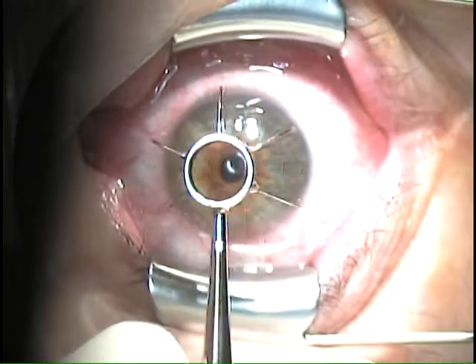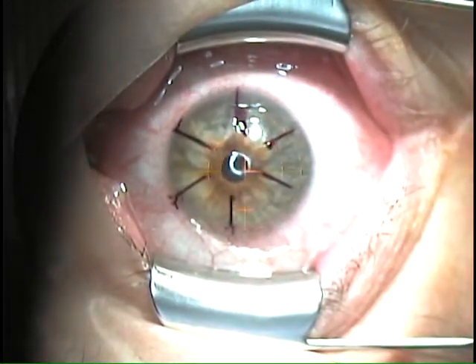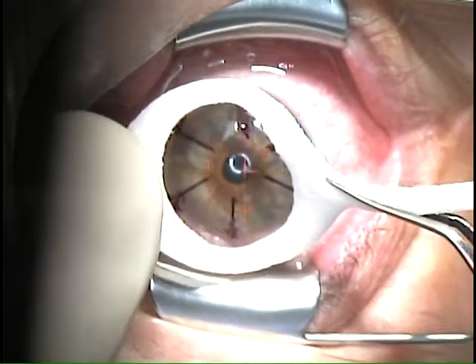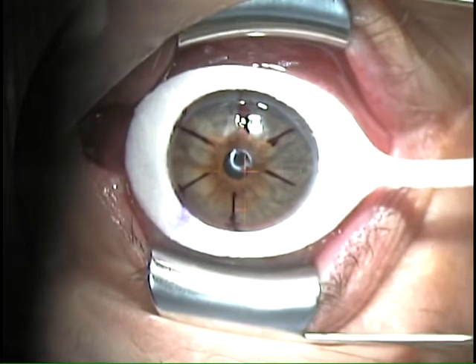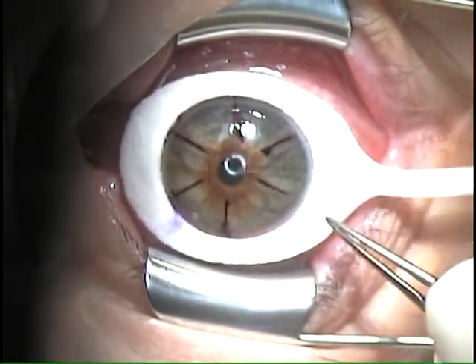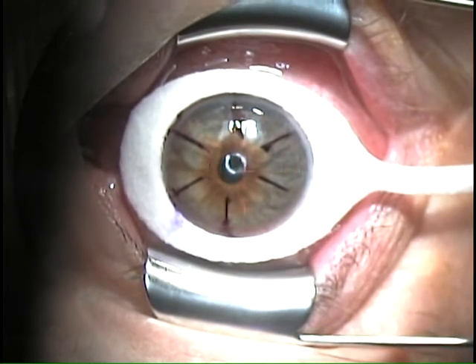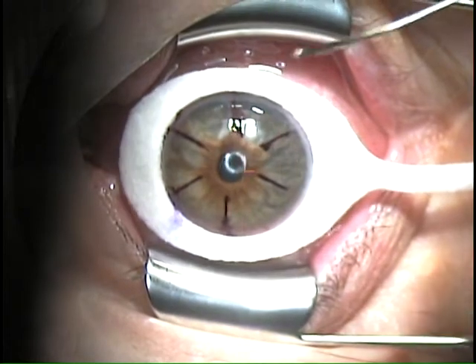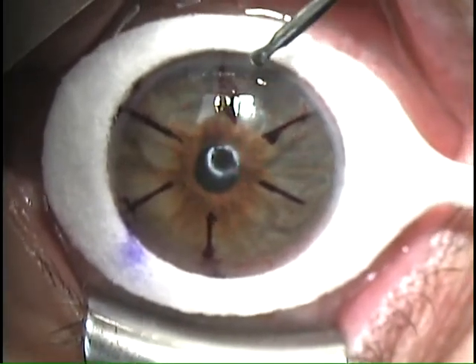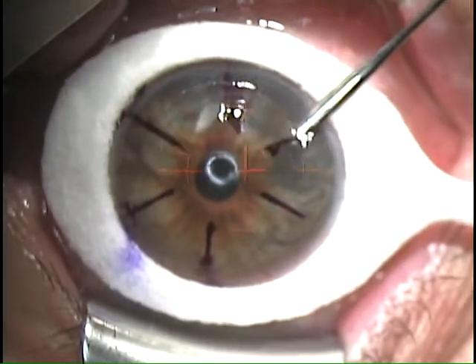To start off, I'm just going to place a mark. And now we're going to take this kind of sponge, which tries to keep the elements away from the outer part of the flap and getting underneath the flap. And I'm going to take this unzipper, and we're going to zoom in here for a second, so you can see where the flap has been demarcated here. And we'll just kind of continue to unzip this guy.